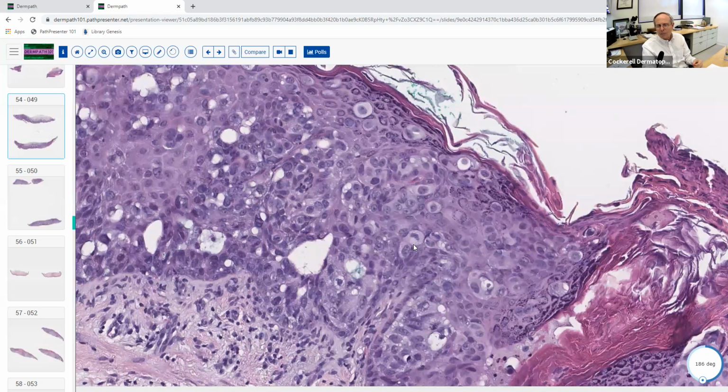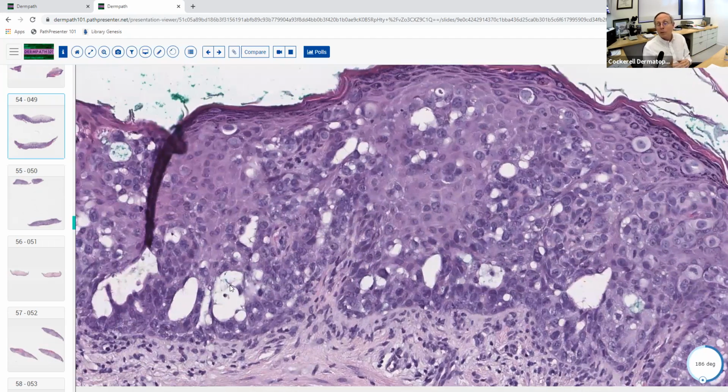And these cells, if you were to stain this for mucin, for example, will be positive here. There are some other stains that we can do. We'll talk about those in a second. But this is a classic pattern of mammary Paget's disease. Now, extramammary Paget's disease can look pretty much the same. And that can also sometimes give you a glandular morphology in the epidermis that's associated with an underlying GU or GI carcinoma that spreads to the skin in a regional localized area. This is obviously the breast Paget's disease in this situation. And then there's extramammary Paget's disease that's not associated with an underlying carcinoma. That just occurs de novo. We think maybe the Toker cells of the skin give rise to that tumor. We're not 100% sure, but sometimes you just see this somewhere that's not associated with any underlying carcinoma at all.